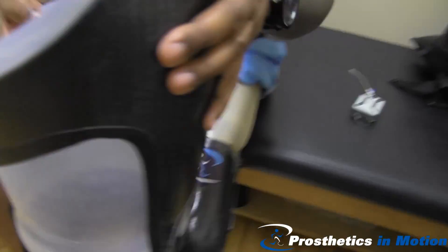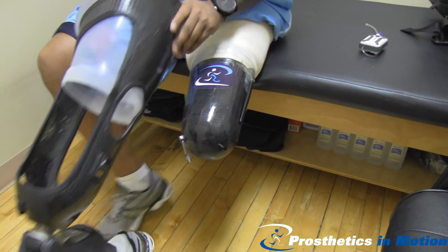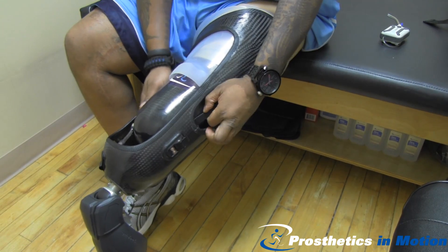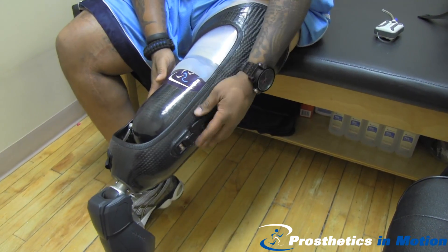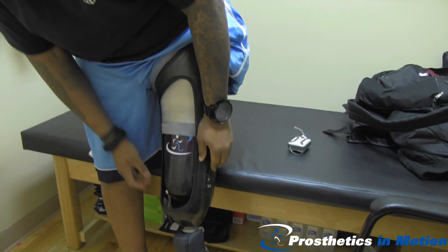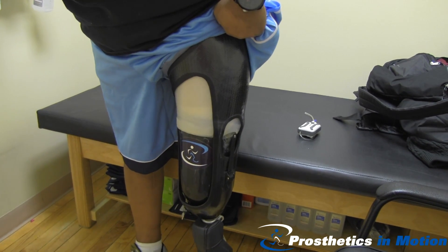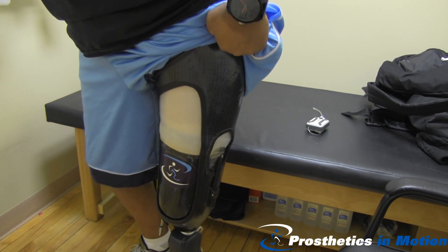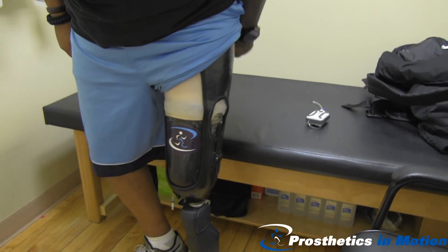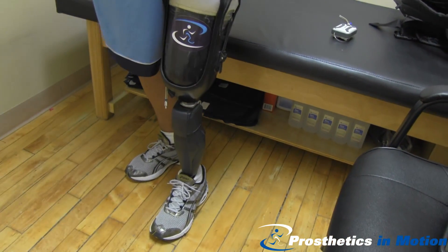Next, he'll take the frame of his prosthesis and insert his residual limb into the frame. On the lateral side, there is a buckle that ensures the prosthesis and the laminated cap are attached appropriately. Even though he does not yet have vacuum, his prosthesis will not come off and he has suction. He is also wearing a Genium microprocessor knee with a nice X2 cover.